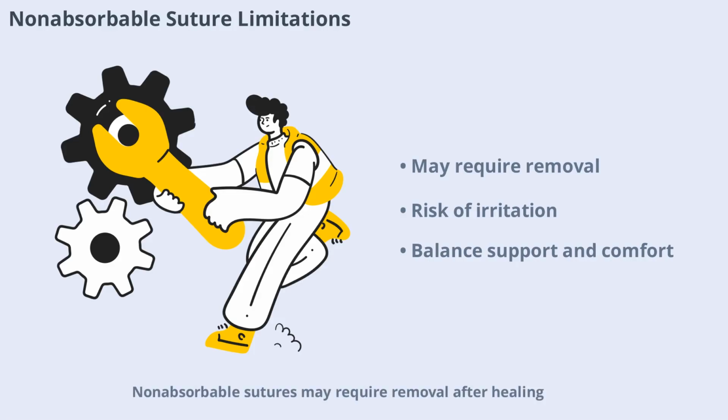Non-absorbable sutures may require removal after healing, which can cause discomfort and risk of infection. Their permanent nature can sometimes lead to tissue irritation or encapsulation. Surgeons must balance the need for long-term support with patient comfort and safety.